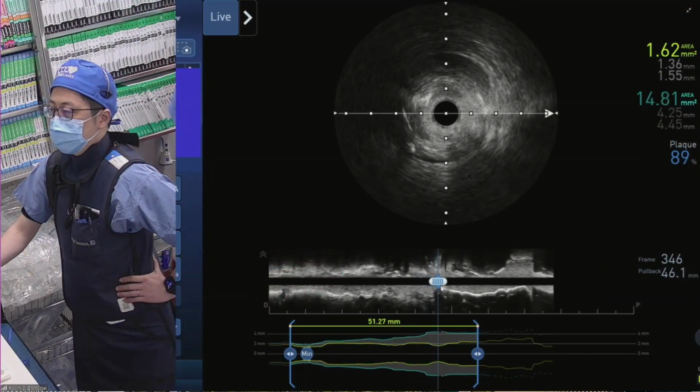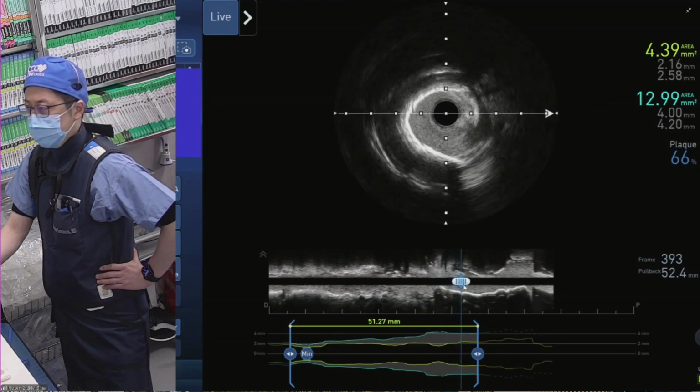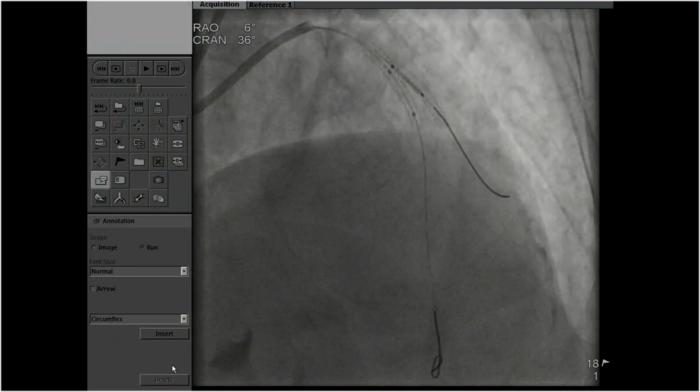Anybody, I then want to go again to the question, Dr. Raja Sharma. Regular balloon, or high pressure balloon, do you think you need a cutting balloon? High pressure cutting balloon, for sure. Good, so that's where we are.